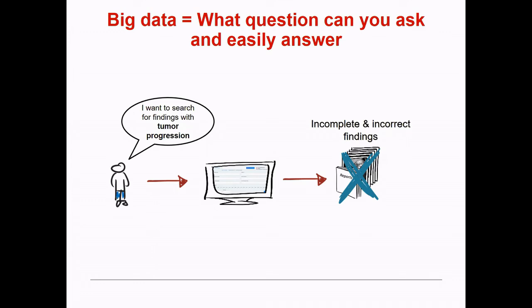And if I want to, for instance, know after chemotherapy who had tumor progression or not, which is really an important question. If it's not inside a clinical study, this question I cannot answer. It's not like I can go to a console and say, okay, who had tumor progression under therapy ABC? It's impossible, because it is somewhere hidden in a longitudinal imaging series in the text. And that sounds like could be this, could be that, could be that.